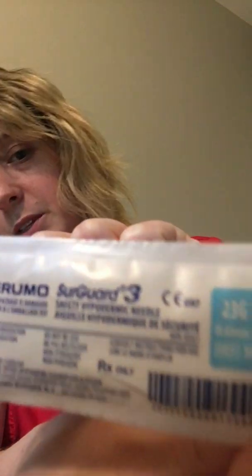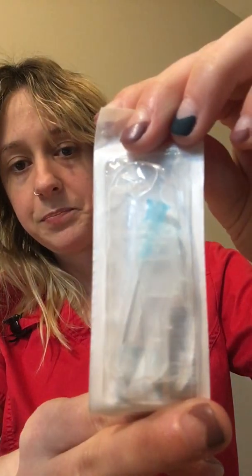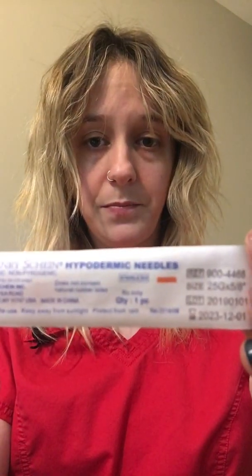First you're going to need some supplies. You're going to need some alcohol swabs, a syringe — I'm using a three milliliter syringe today — and then two needles. Testosterone is very thick and kind of hard to suck up, so we usually have you draw up the medicine with a bigger needle: a 23 gauge one inch needle. Then you switch to a 25 gauge 5/8 inch needle to actually inject. You'll also need the vial of medicine and a band-aid.